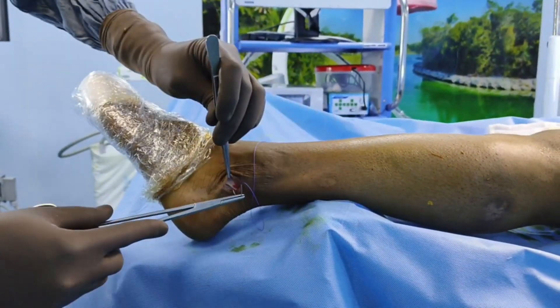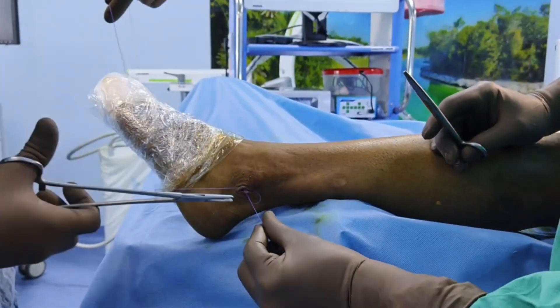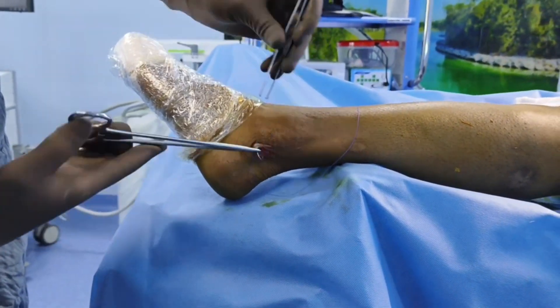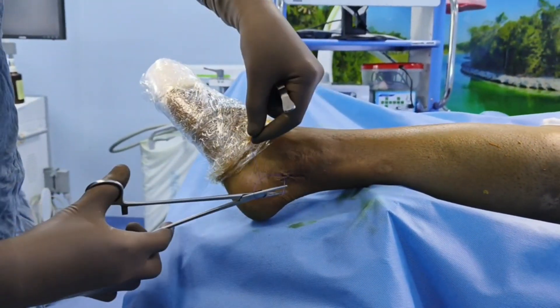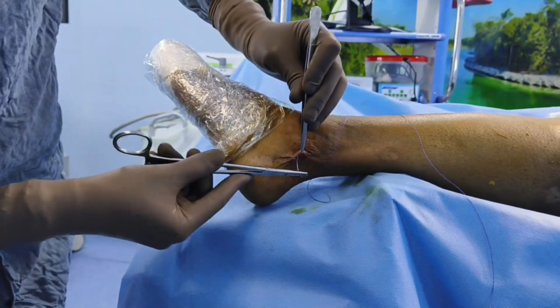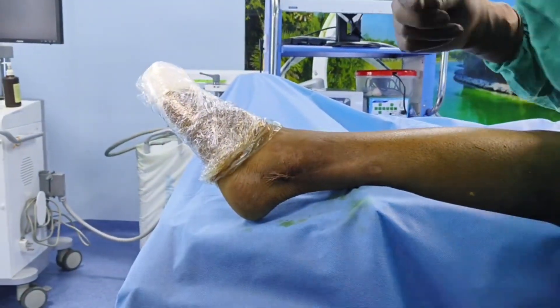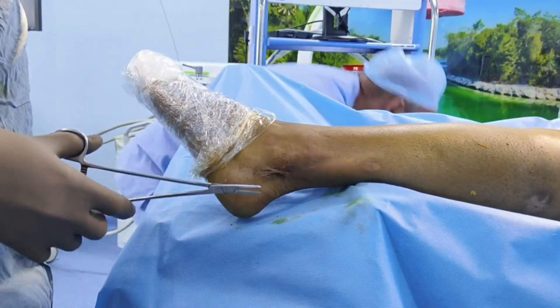Now you have the tendon in your hand. The next step is to close the wound. First, repair the peroneal retinaculum — this is very essential, otherwise there will be bowstringing of the peroneus brevis tendon. Then take two to three bites in the subcutaneous plane using Vicryl or any absorbable suture. For the skin, you can use nylon or any non-absorbable monofilament suture, or you can use a skin stapler.